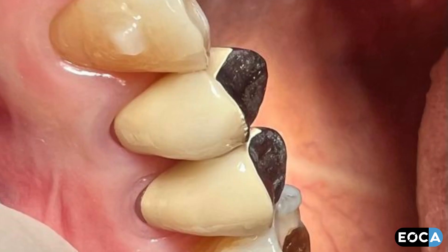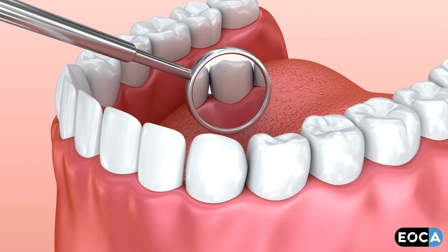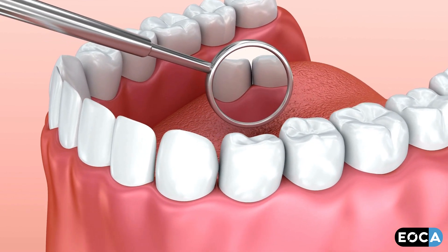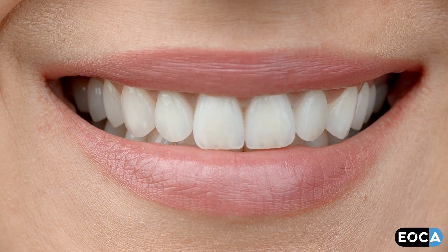The outcome of utilizing these burrs includes smooth, undetectable margins, plaque-resistant surfaces, healthier gingival tissues, increased longevity of restorations, enhanced aesthetics, and proper contours.